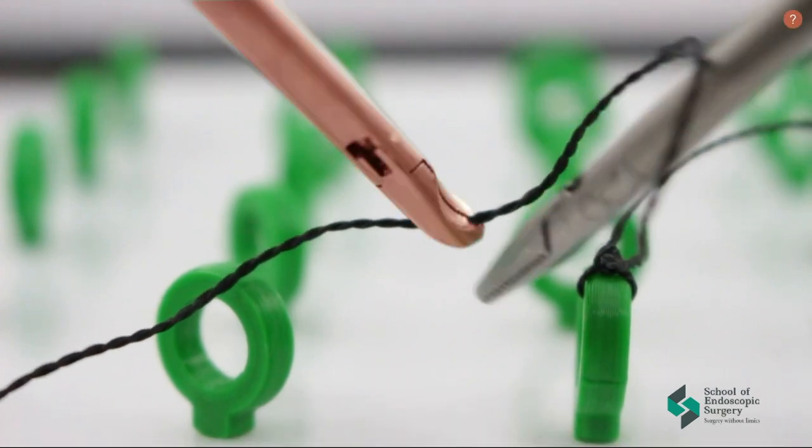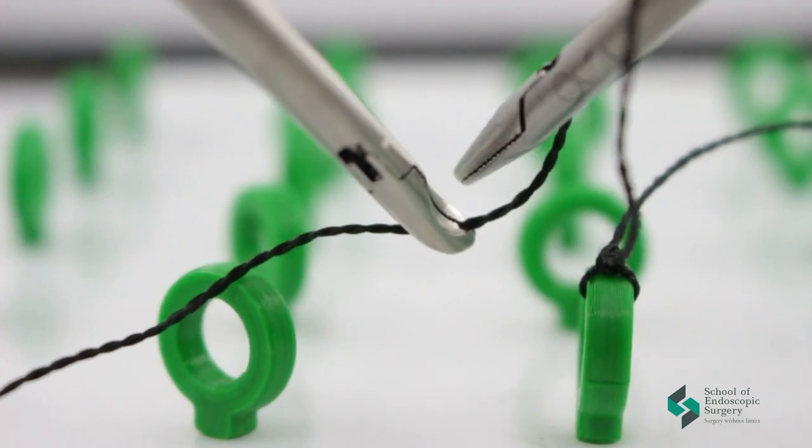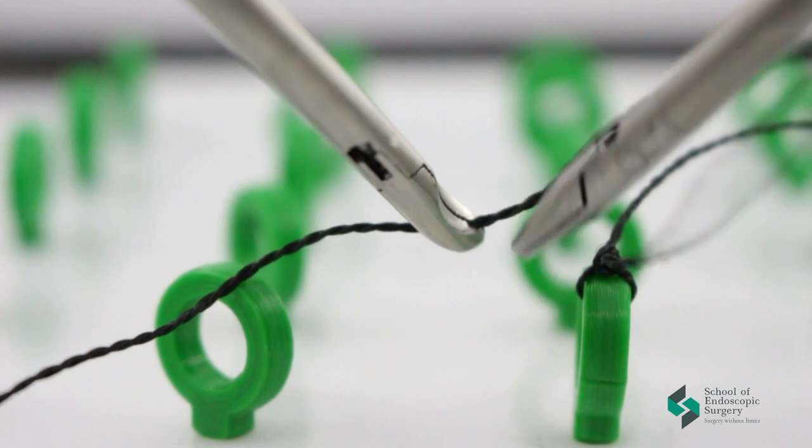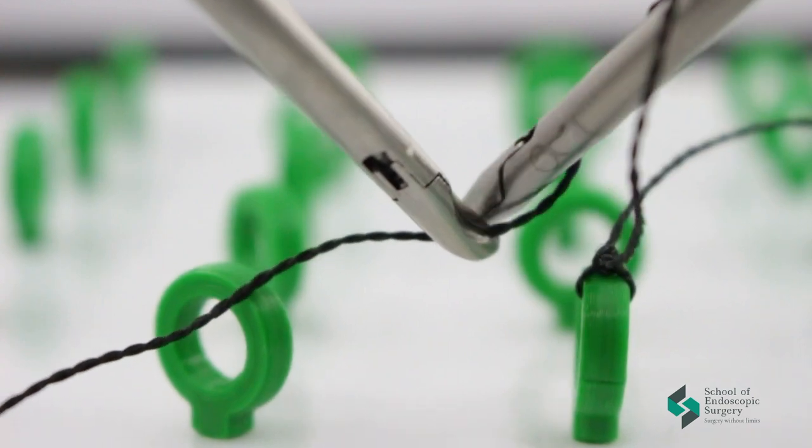As you can see, the training of the intracorporeal knot consists of three main steps. The first step is you must hold the thread with one instrument and start rotating the thread along the axis with other instrument.